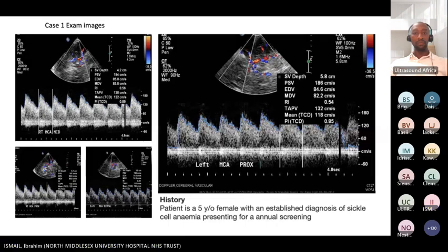Okay, I think it's always better to allow the ultrasound machine to determine the velocity values. I think as humans, we are flawed in our analytical skills at times.